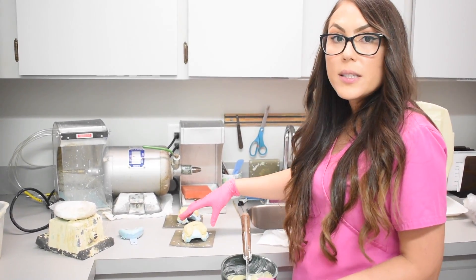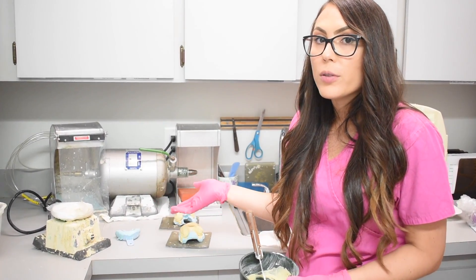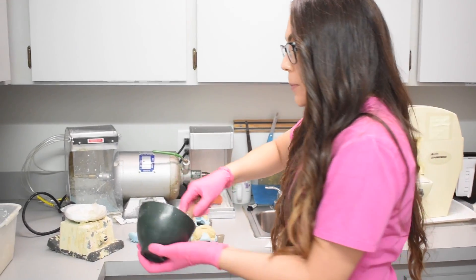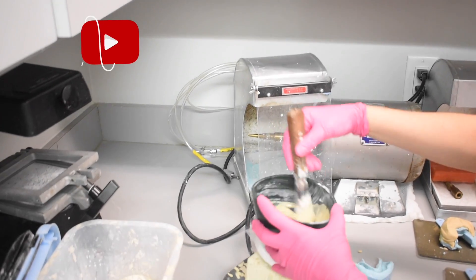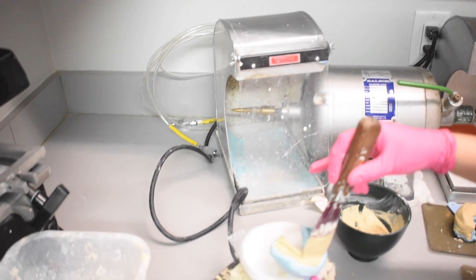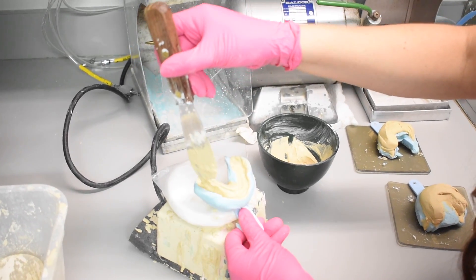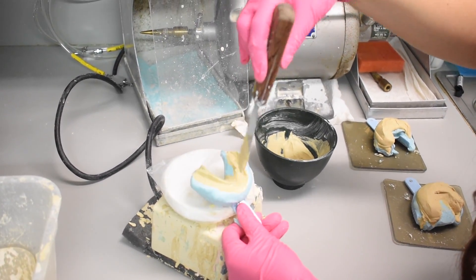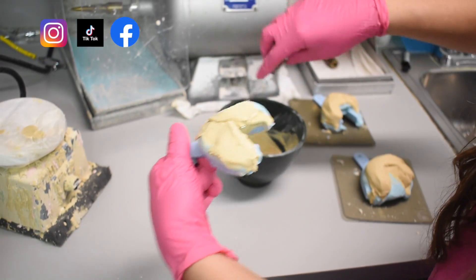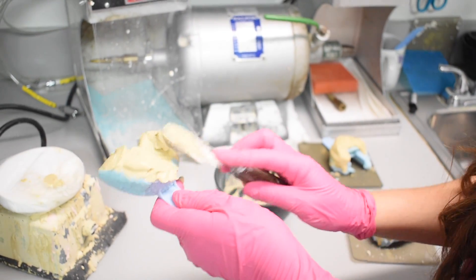Okay guys, so Carla showed you the way she does it — it's pretty interesting how she does a U-shape and she doesn't build a palate. This way you most likely won't have to trim the models anyway. I personally want to make sure I'm not going to need to trim that model, because that's an extra step you don't have to do for a bleaching tray. So I'm going to go ahead and not even make a base — I'm just going to pour it and make sure there are no bubbles and it's not too runny.